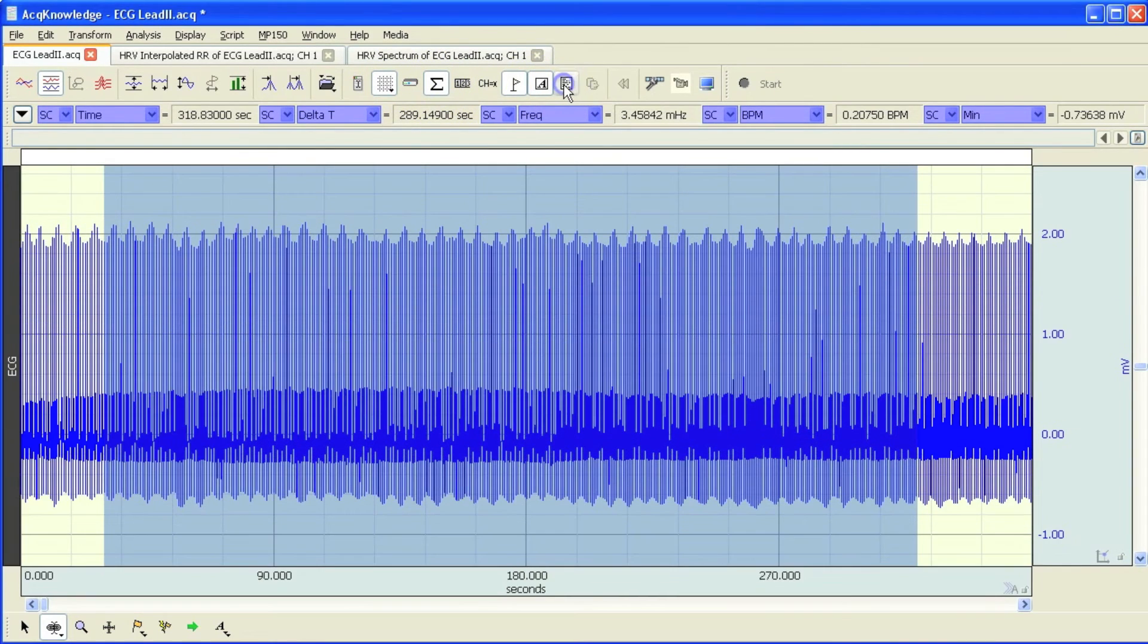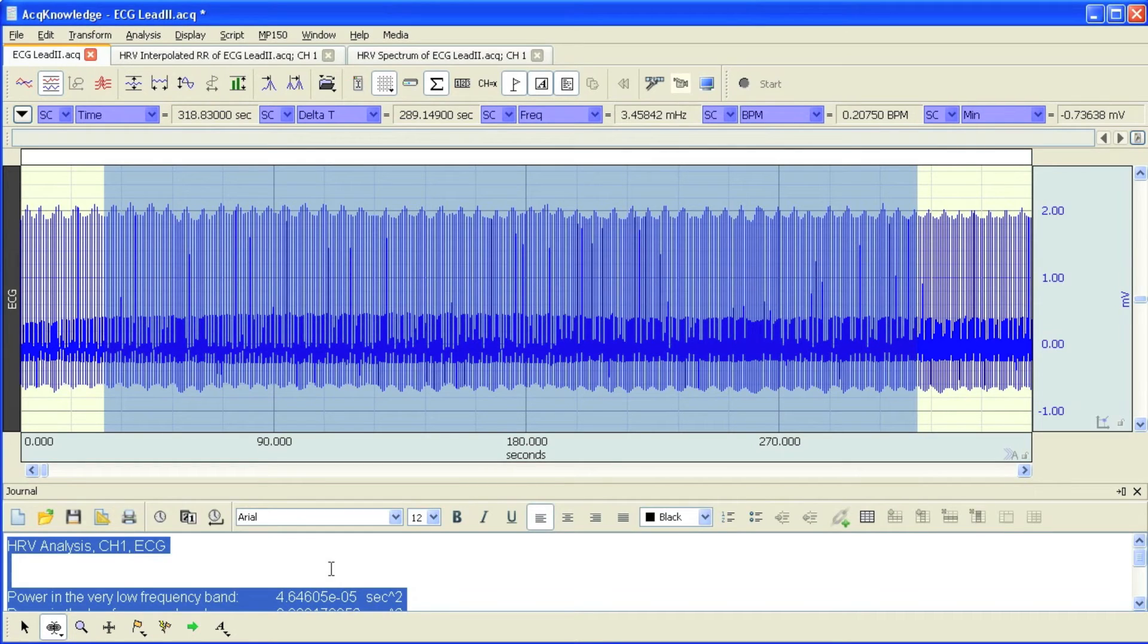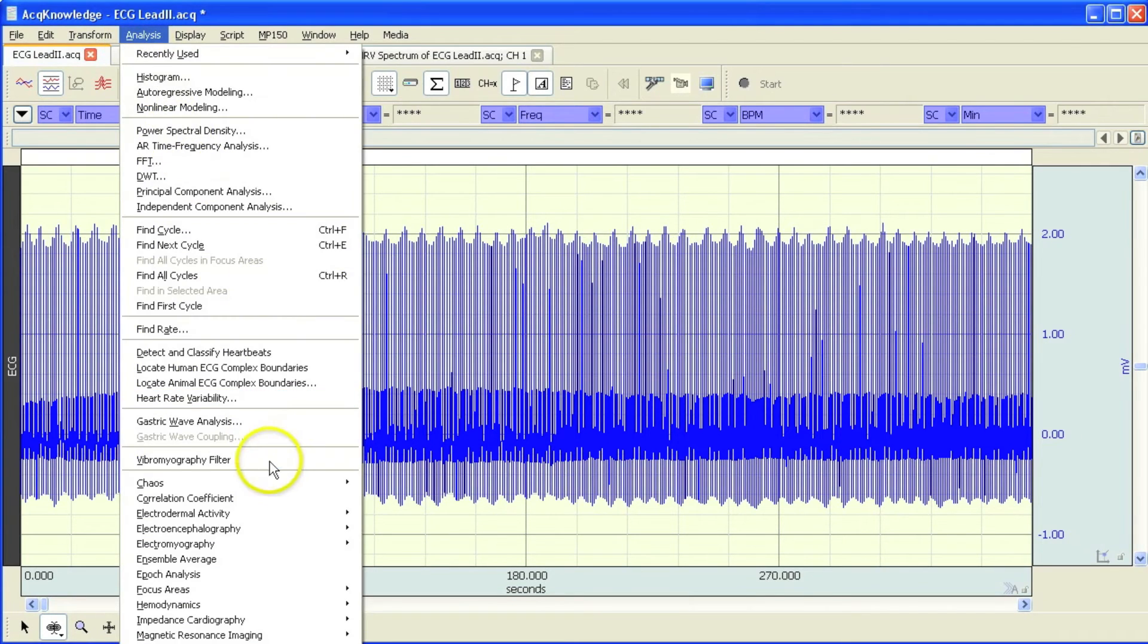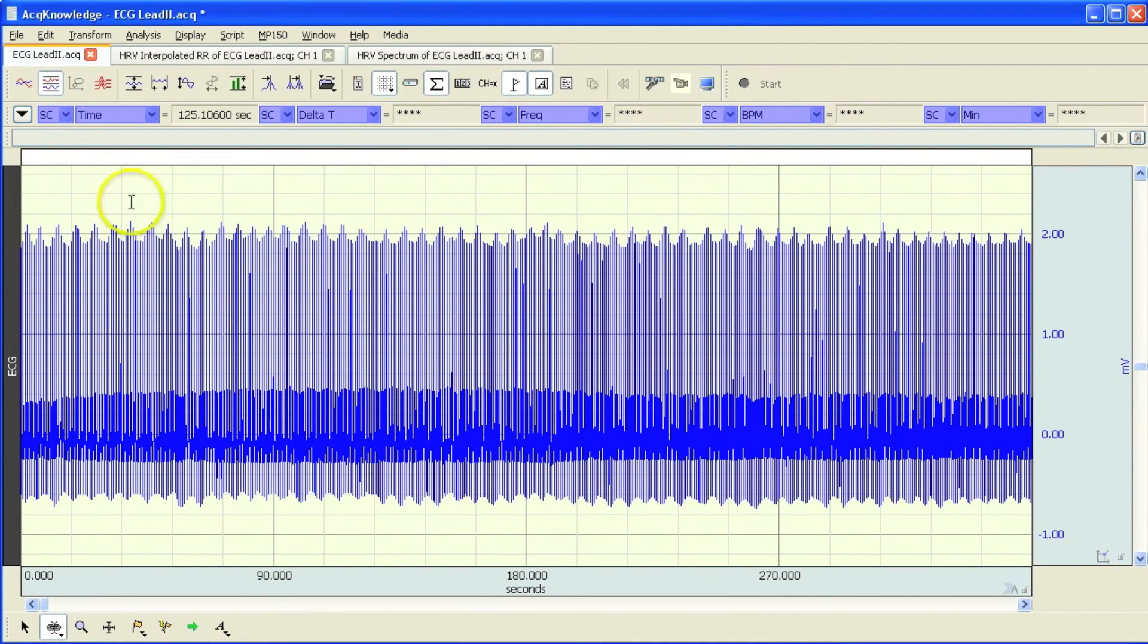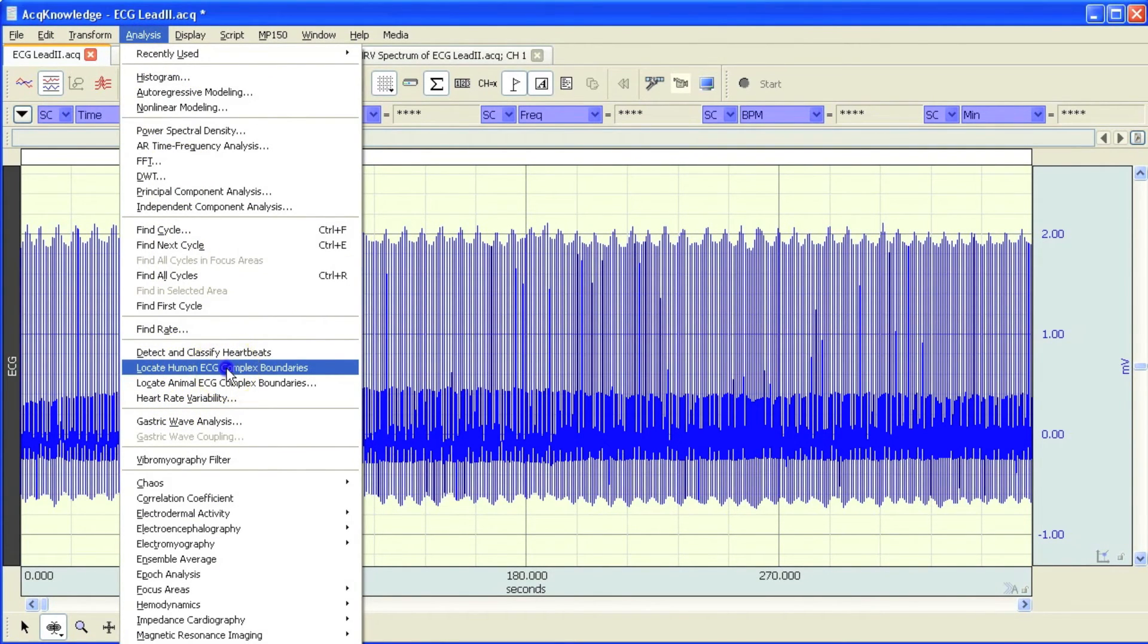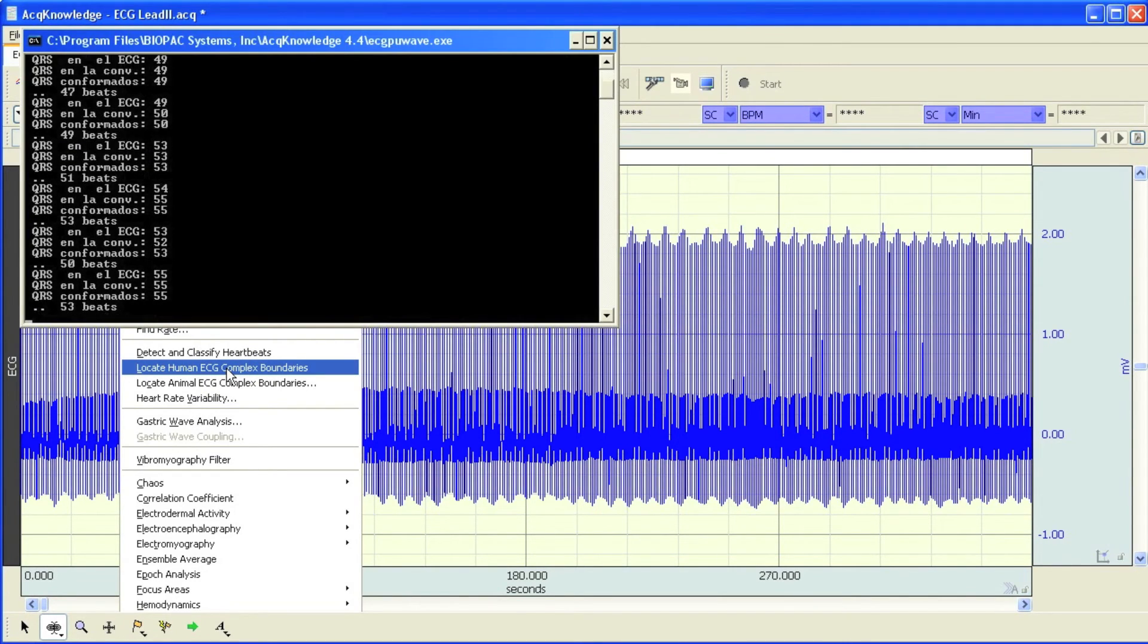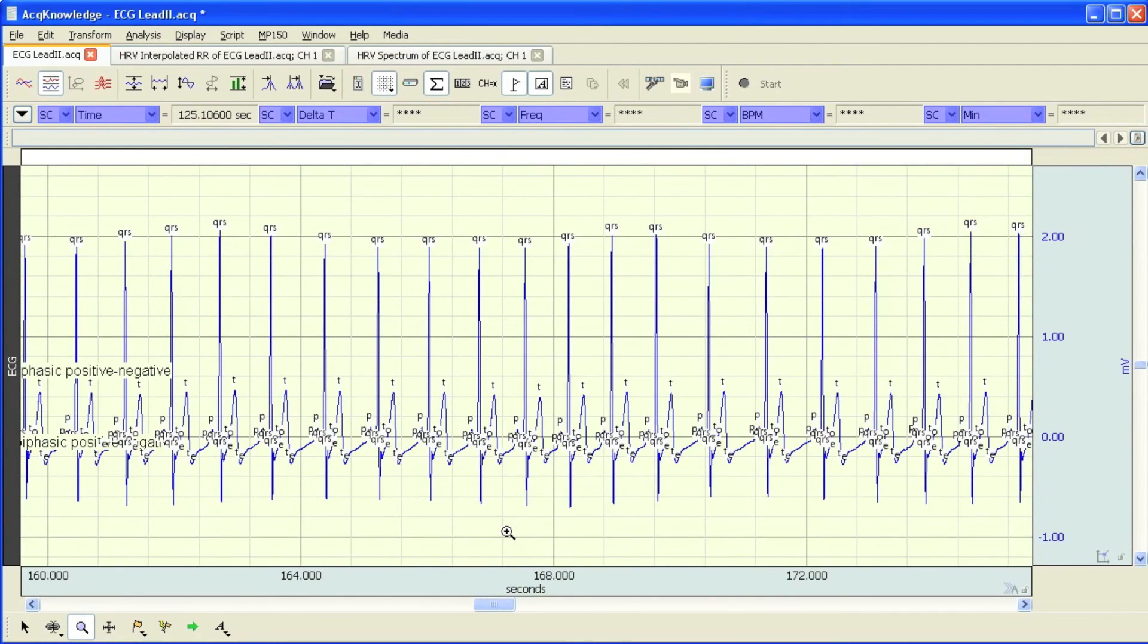If I close that out, or actually if I clear this out and then close it, I can now show you the option which is to use the events. Now at the moment, this file doesn't contain any events. So I need to go into the analysis menu and I'm going to locate ECG complex boundaries. So the software is going to go through and it's going to locate each of the points of the ECG complex. And it's pasted a QRS label at the top of each of my waveforms, like so.